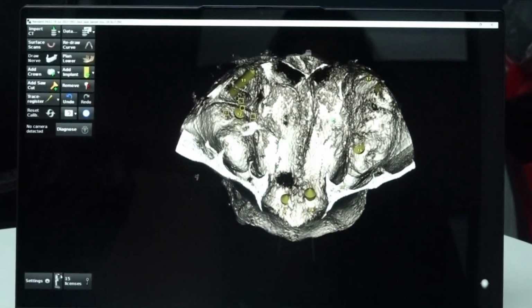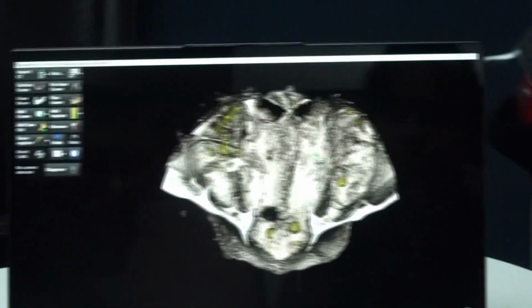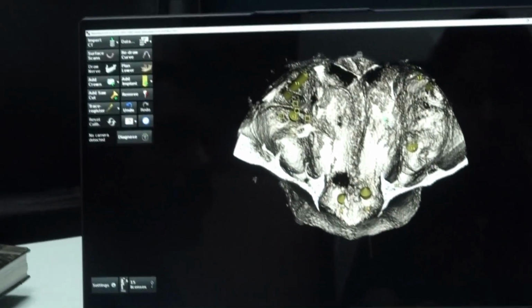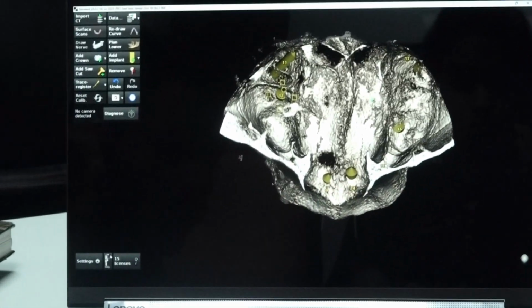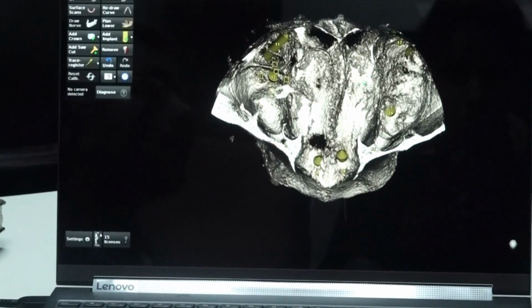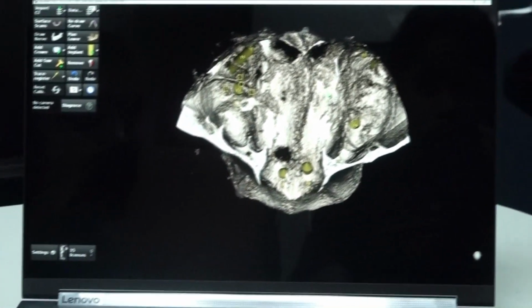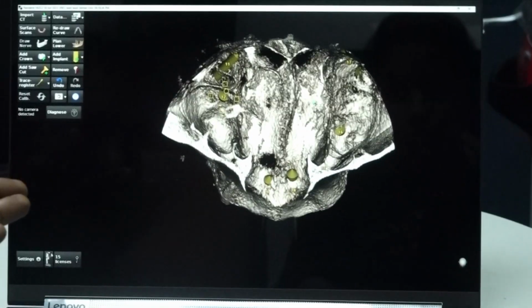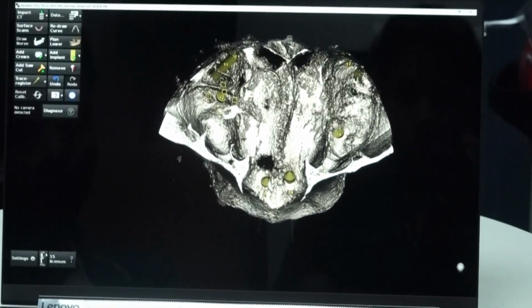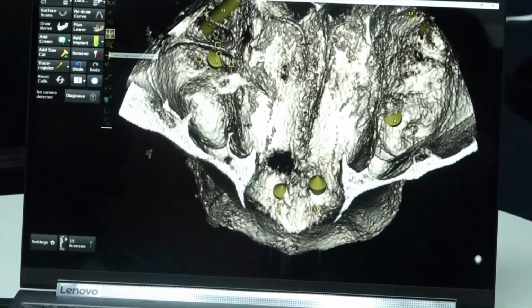But of course there are certain instances where we have to increase the number of implants, like osteoporosis and all. But without breaking the rule. What rule? A safe inter-implant distance. Doctors see only the inter-implant distance at the crestal level. But what about the nasal floor level? Of course, if you see this picture, we have selected a 4 mm implant.